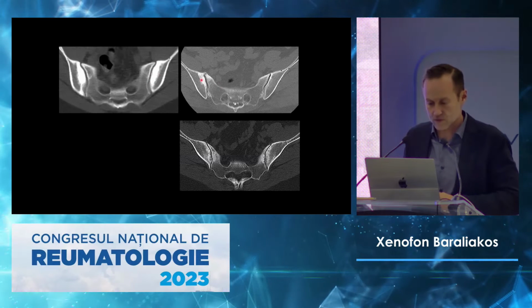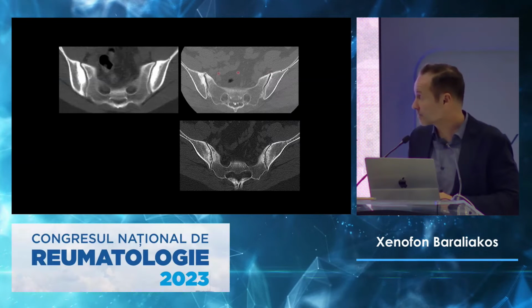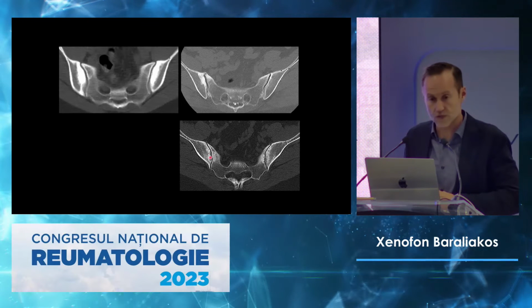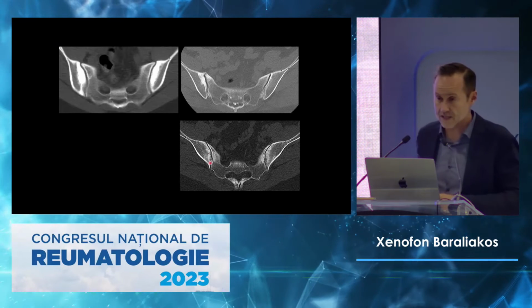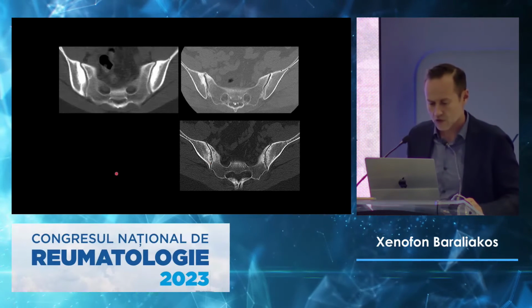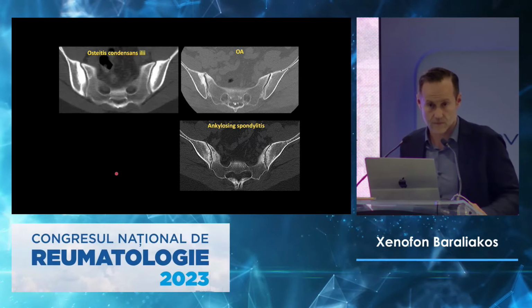We have some sclerosis, but some changes that go like this. You remember we found that before. And we also have some sclerosis, but a lot of erosions in the cartilage. These are the findings that, of course, you have a patient in front of you always, and you have the symptoms and you have the lab. But based on imaging, you will make different diagnoses. Yeah?